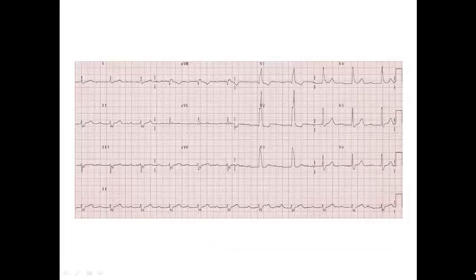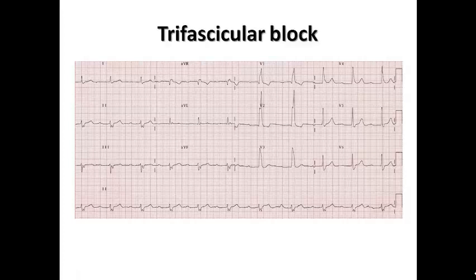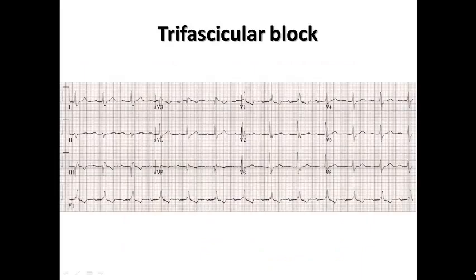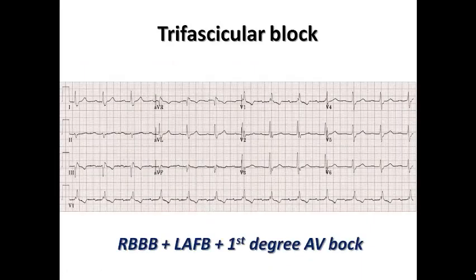Using the first definition, trifascicular block means complete right bundle branch block plus left anterior fascicular block — indicated by left axis deviation — plus first degree AV block with PR interval more than 200 milliseconds. Sometimes it may instead be left posterior fascicular block. As seen in most ECG examples here, it is left anterior fascicular block because it is much more common than left posterior fascicular block.